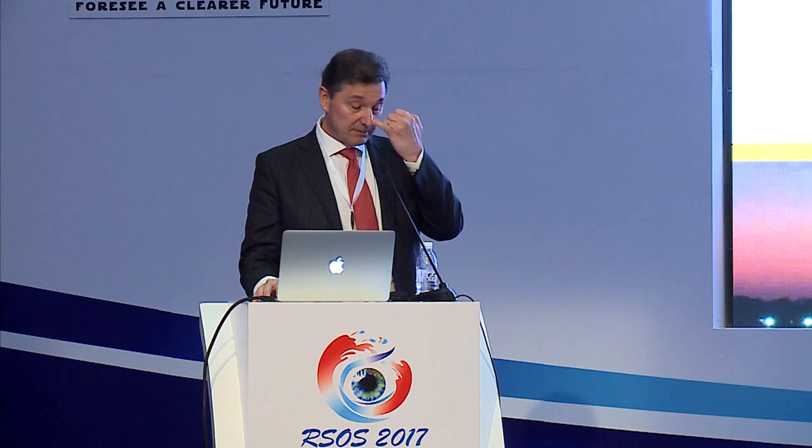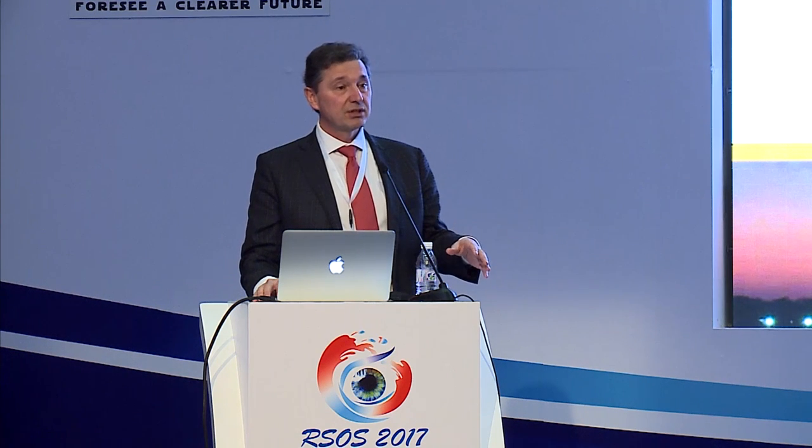So in topography, you need to look at a number of things. What is the corneal astigmatism? When you're doing a refractive procedure on the lens, you're going to unmask what's happening in the cornea. We have a number of patients who are basically no cylinder refractively, but have 2 diopters of corneal astigmatism. So you now know they've got 2 diopters of lenticular astigmatism. When you remove the lens and put a standard lens in, you're going to unmask the corneal astigmatism. Angle kappa is important, especially with multifocal lenses. And corneal regularity is very important, again, especially with multifocal lenses. So corneal astigmatism, you need to know the magnitude, the axis, and whether it's regular or not.